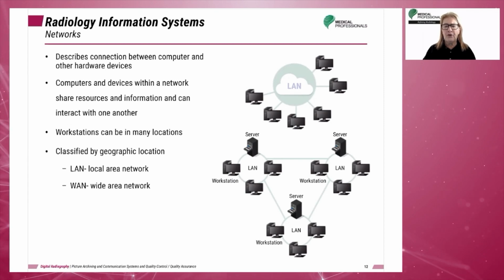The term network is used by computer scientists to describe the connection between computers and other hardware devices that share resources, data, and information. Computers that are used in healthcare institutions are connected through networks. Networks can be sorted into two major categories: local area networks, or LANs, and wide area networks, or WANs.